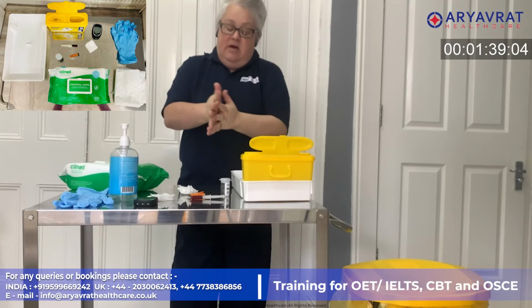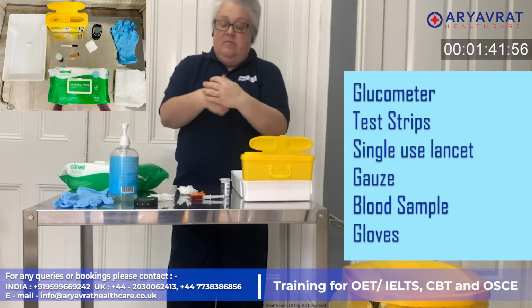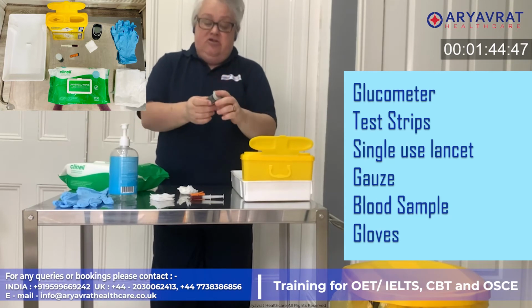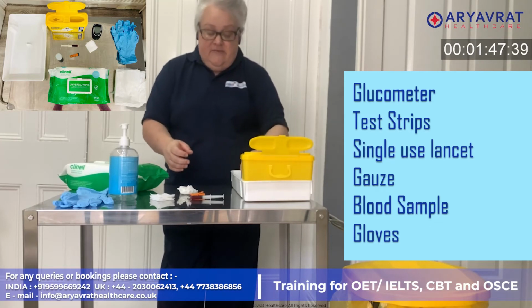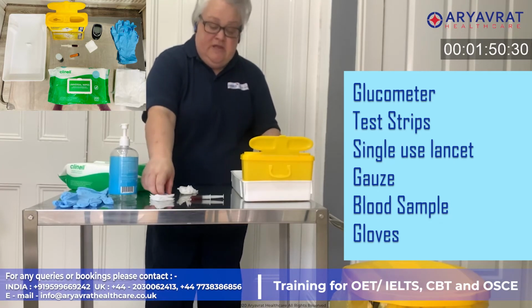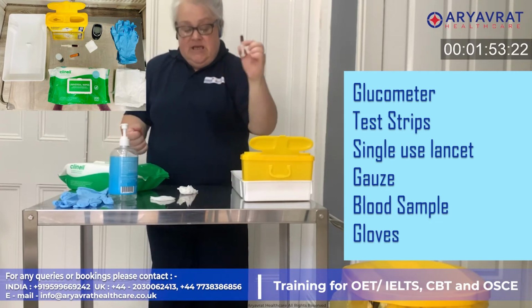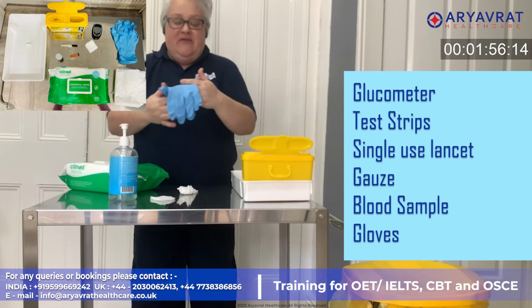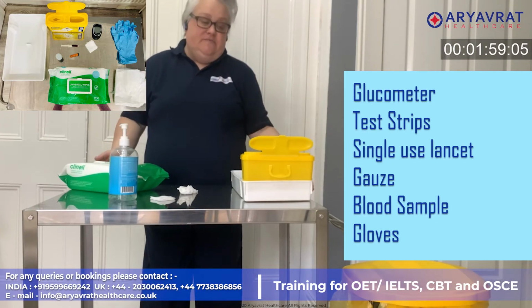So for this, I am going to need a glucometer, and I have already checked that it's calibrated and safe to use. So I have my glucometer and I have my test strips. I'm going to double check the expiry date on those, and they are safe to use. I am going to need a single-use lancet, which will be disposed of in the sharps box. I will need some gauze for wiping the end of the finger, and this is our blood sample that we haven't yet got, and we are going to get from our patient's finger. So I'm going to need one clean pair of gloves, and I'm ready to go back to my patient's bedside.